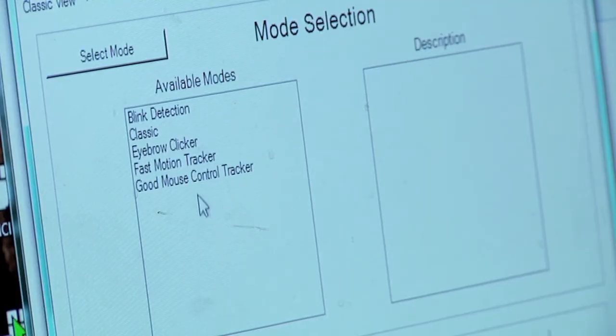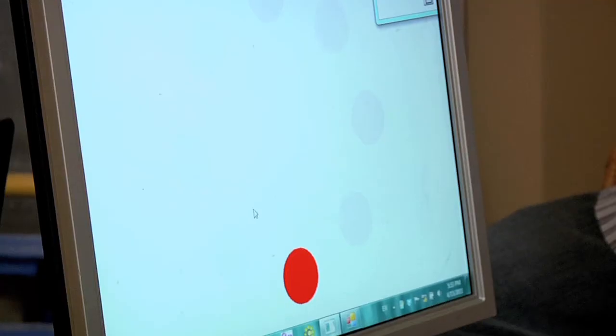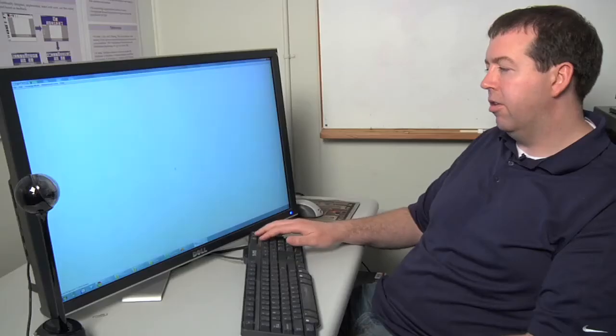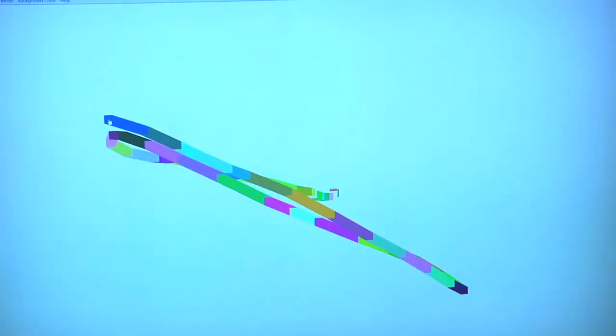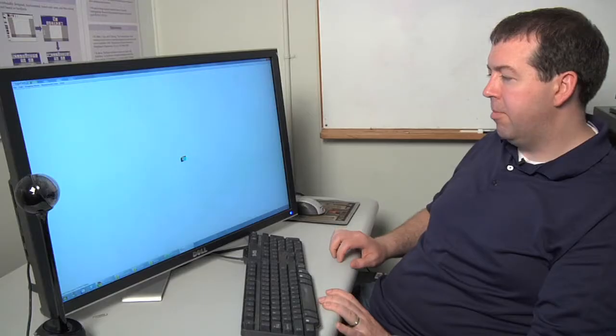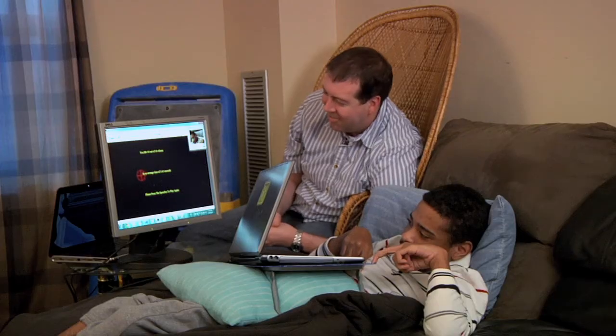Select the good mouse control tracker. Try moving left and right — see how it responds when you move. A user with disabilities who holds his head at an angle might move the mouse pointer diagonally when he means a horizontal motion. What my software does is take their actual motion and translate it into their intended motion. With the adaptive mouse, I can move my head diagonally and still have the mouse pointer move horizontally. You zoom straight across and we're able to hit it. Did you find that easier with this setting? Yes. That makes me pretty happy.